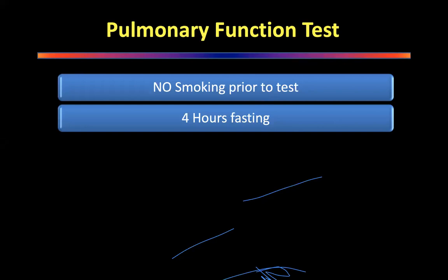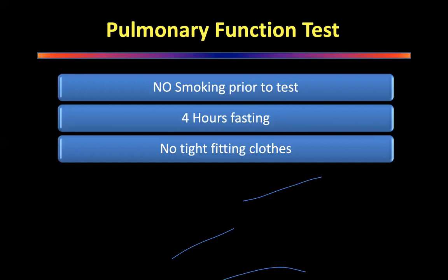And the last thing you want is to vomit with a machine in your mouth. The chances are you will aspirate, and so you don't want any mishap. So preferably you should try and keep 4 hours fasting. Again, PFTs depend on not just the lung but the accessory muscles of respiration and the abdominal muscles.